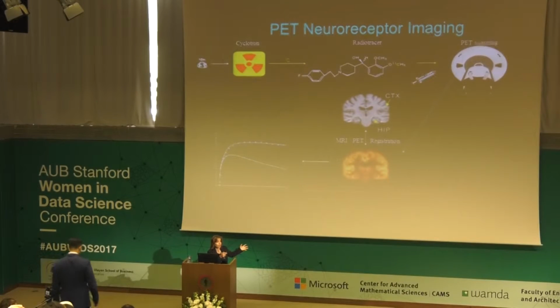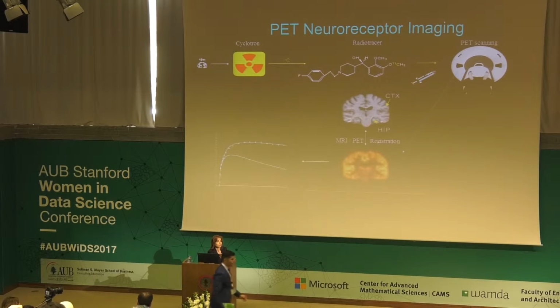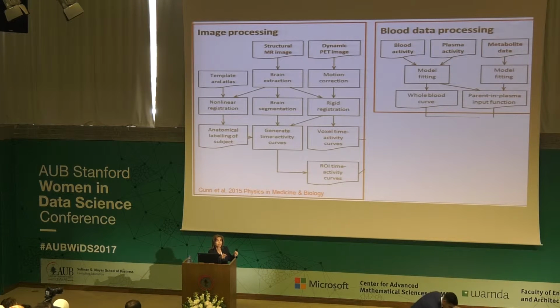The second big analytical step is to quantify the input function, which is what goes into the brain, the radioactivity that's going into the brain. We need to estimate out of this what is the actual free parent radiotracer and what is metabolites, and all this goes into the calculation. So that is another kind of chemistry, data analysis, big operation to figure out how much at every time point the radioactivity is composed of radiometabolites versus the parent radiotracer, because it's really the parent tracer that is bound to those sites in the brain.